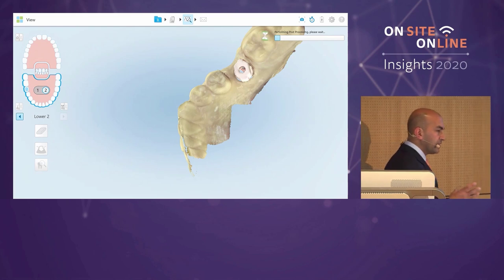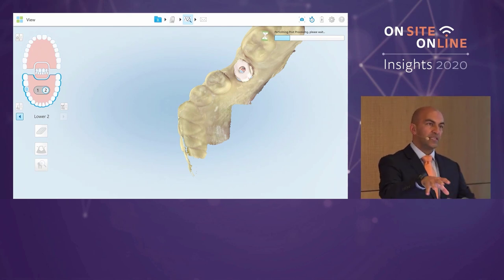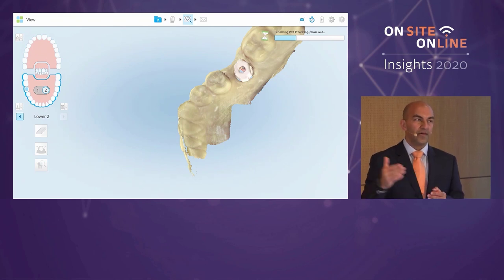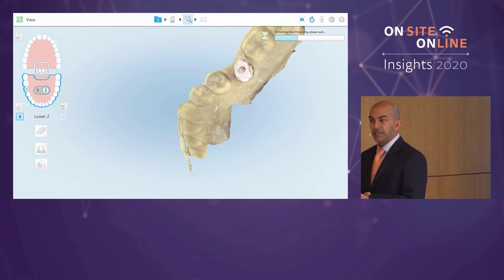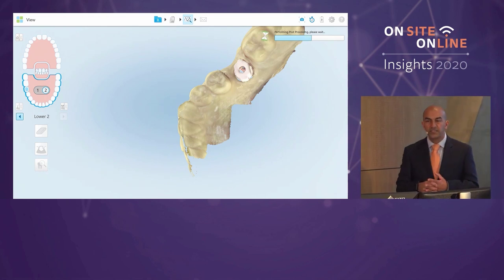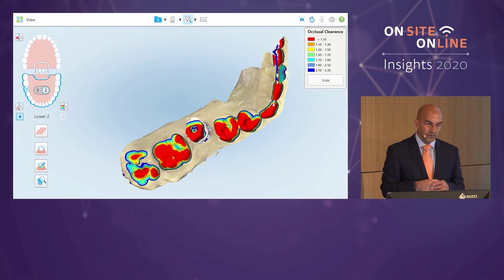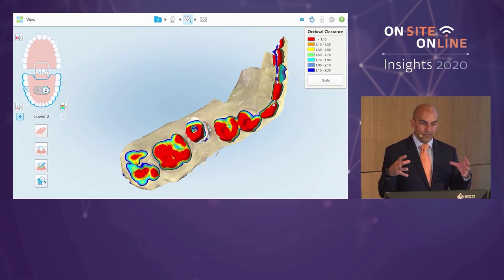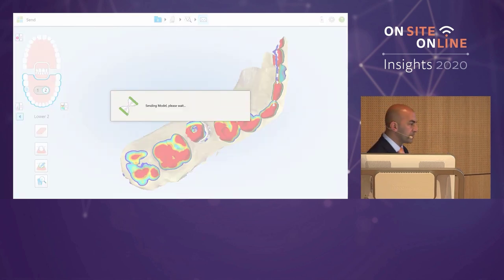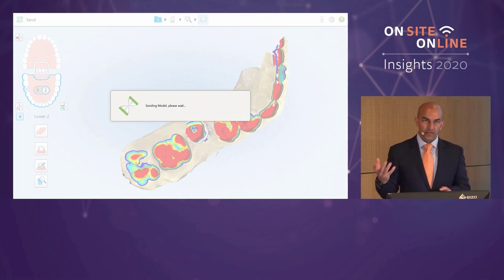There are more scans here so post-processing takes a little longer. All the data will dump straight into Exocad, where I'll check in DB and then take you through the design steps. Hopefully we'll also mill this restoration — it's going to be a screw-retained restoration on a tie base. After that we'll move to Exoplan. We're 35 minutes in and already on our second case. The reason I started with a simple case is to show that Exocad keeps continuity between platforms, so features you learn on a simple restoration carry over as you advance.